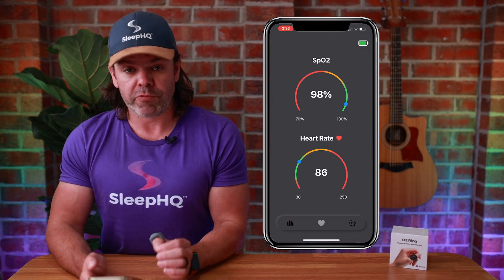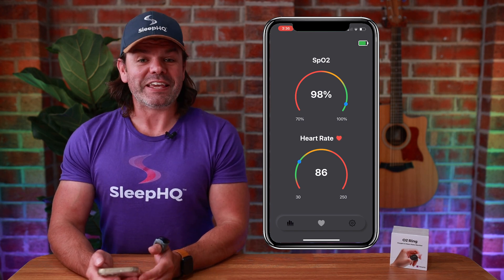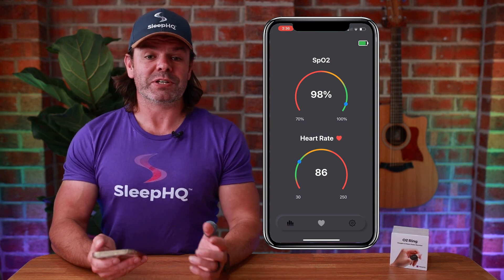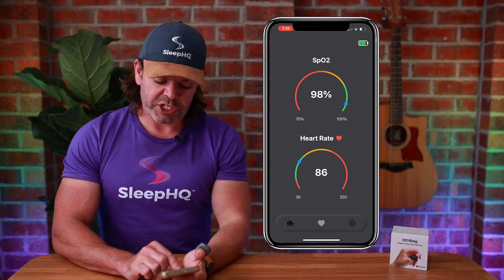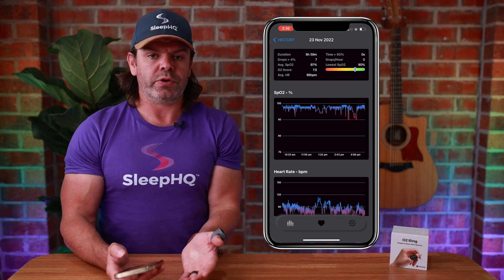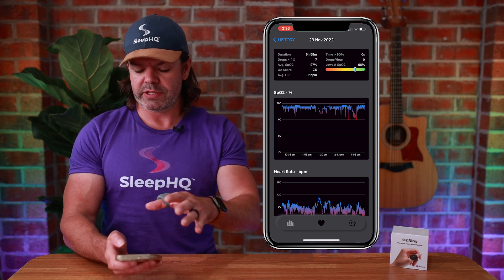Here we have it right now in real time: my blood oxygen level and heart rate — a very healthy 98%, that's great. Heart rate is a little high at 86, but that's because I'm obviously so excited about what I'm sharing today. If we come across to the chart tab, we can also check out our O2 charts. If you have data on your O2 ring, all that information will load into the app automatically.